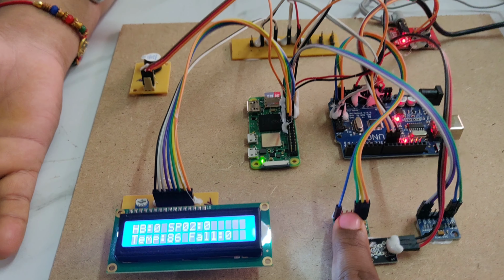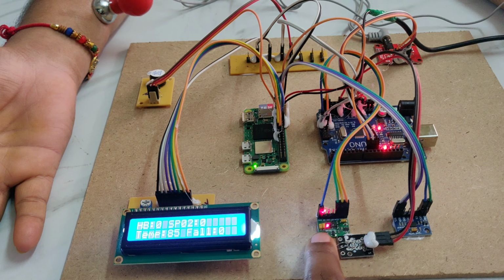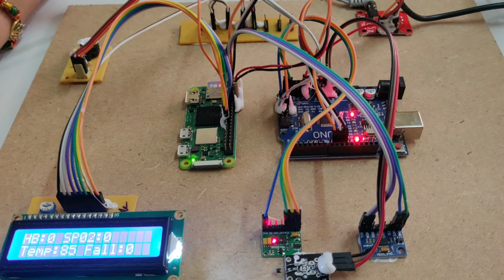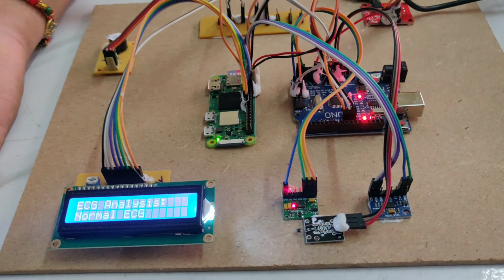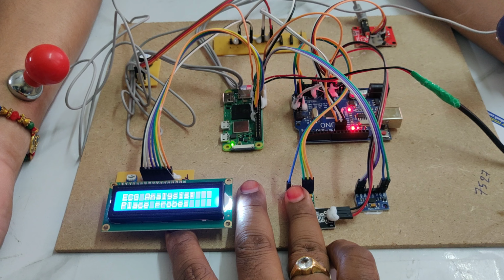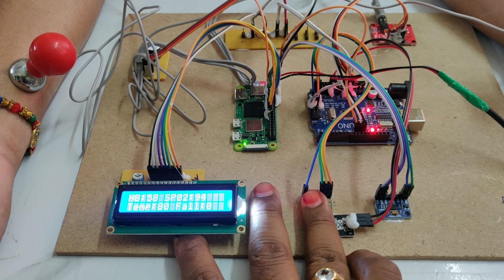This is the normal section here, ECGs. And there is a temperature sensor, MAX30100, and a MEMS sensor for fall detection. So this was the heart rate along with SpO2 values.